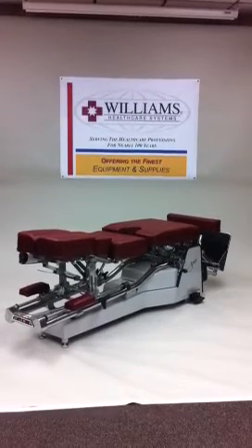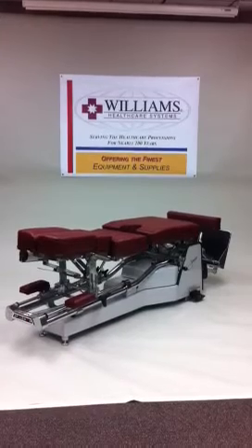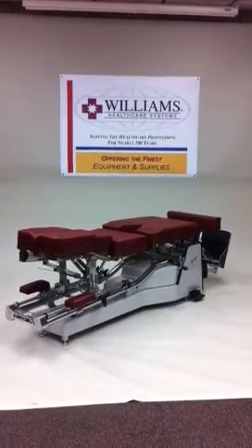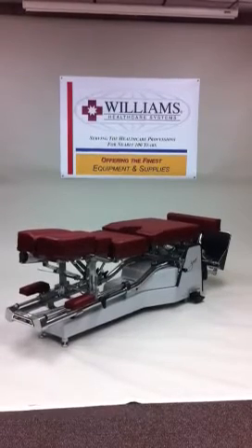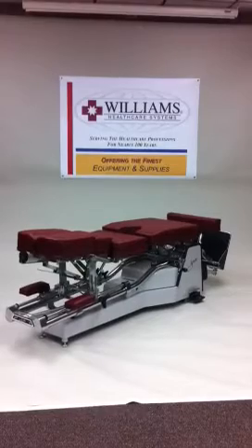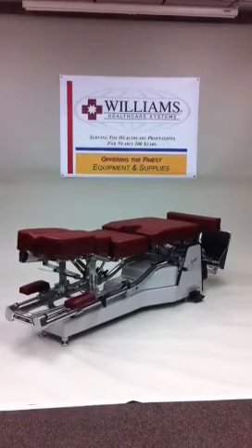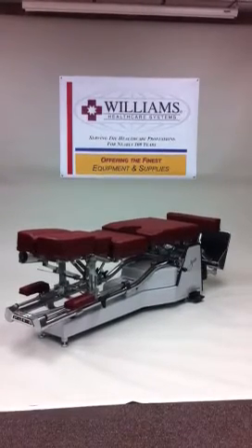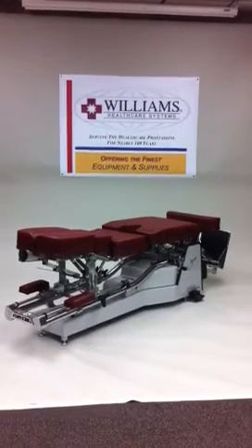Our famous lumbar cushion locks and releases and includes adjustable tension for controlled resistance with a convenient new lock design. The pelvic cushion slides and cranks for proper patient positioning and is also available with our famous terminal point pelvic drop. The front and pelvic sections adjust for a wide range of patient needs and are contoured for their comfort.